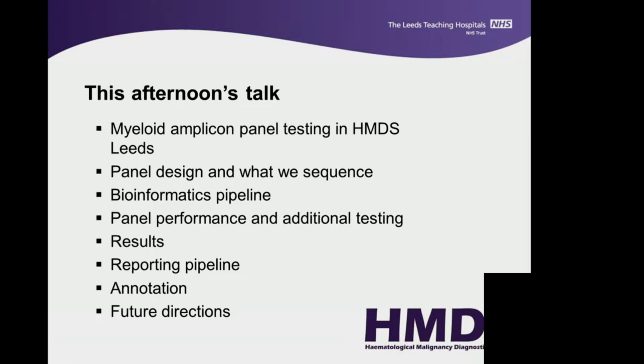But since then, we've been using the MiSeq. We've used the same library preparation system for both systems. Again, it's not off the shelf like a lot of the kits are nowadays. It's a bespoke assay. So first and foremost, I'll talk you through the assay.